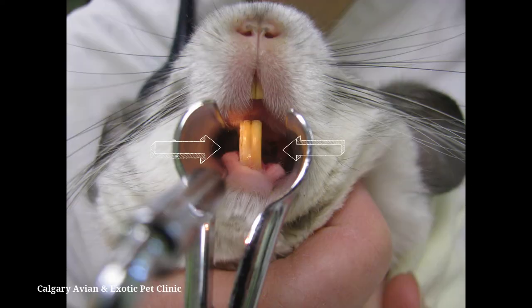The tip of the feeding syringe should enter the chinchilla's mouth from either the left or right side. There is a toothless space called the diastema behind the incisors. Insert the syringe tip in this space.